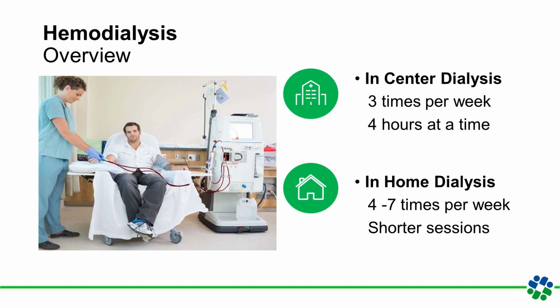As mentioned, the first is the in-center dialysis, which typically involves 3 sessions per week, each lasting for roughly 4 hours. And in this setting, you're in the hands of a medical professional who oversees the process, ensuring your health is cared for efficiently and safely, and it's a scheduled commitment to your well-being. The second option is in-home dialysis, providing a little bit more flexibility. This treatment can be done roughly 4 to 7 times a week with shorter sessions. Home dialysis allows you to integrate the treatment into your daily routine a little bit more comfortably and enabling you to manage your health within the familiarity and comfort of your own home.